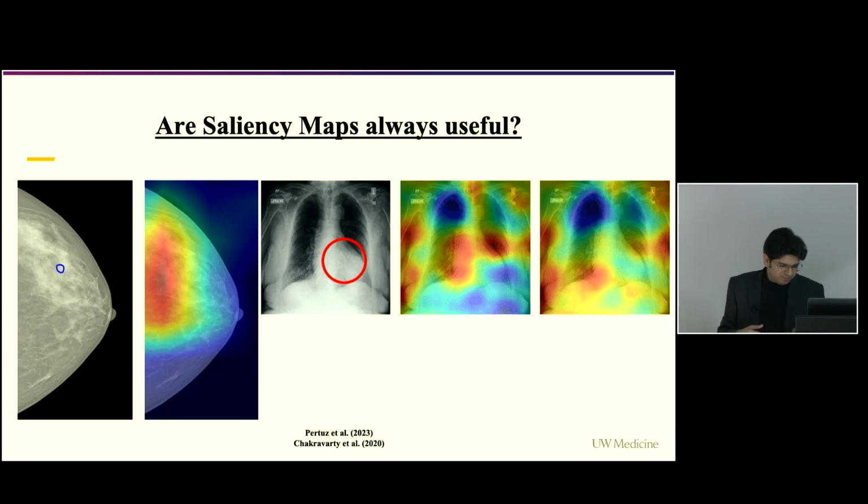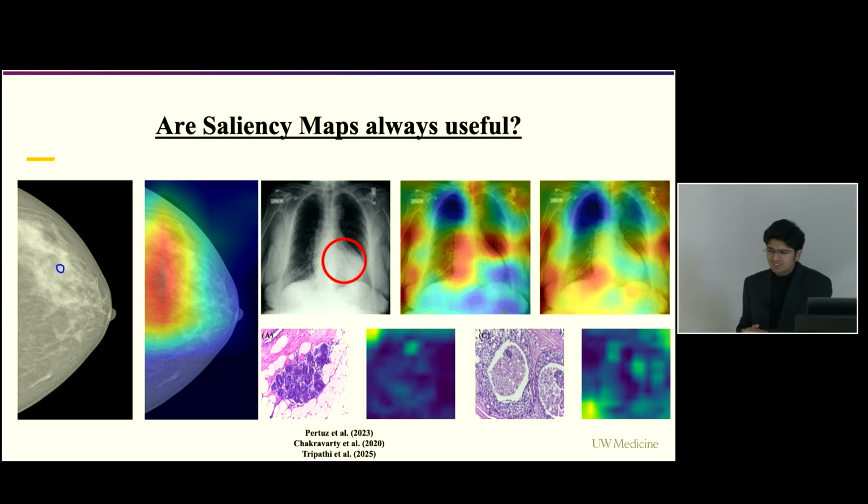It's not really clear. How about this? In this last image, this visualization, do we think saliency maps are helpful? Is this visualization helping us understand the model's latent inference mechanism, the magic that the model is doing? To me, it's even unclear what exactly it is highlighting. So now we would want to test the saliency maps better to understand whether they really hold potential to explain deep learning models or not.